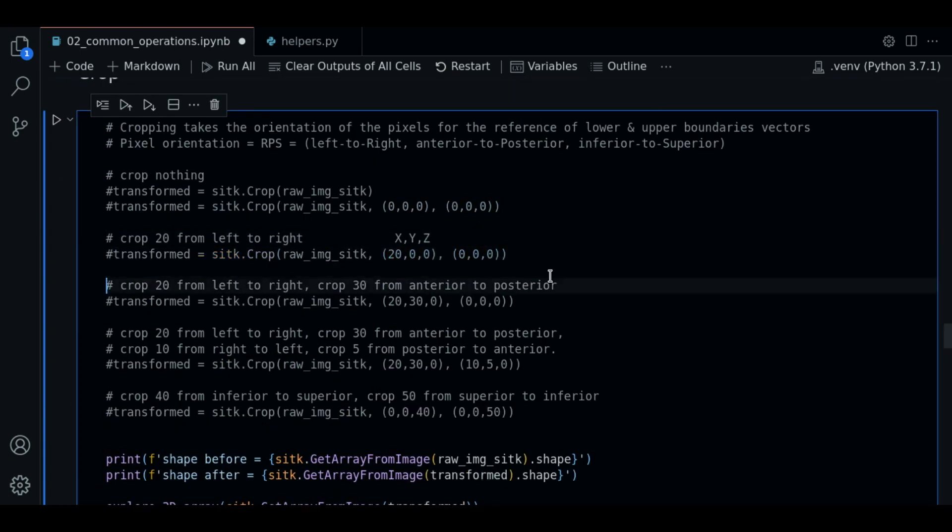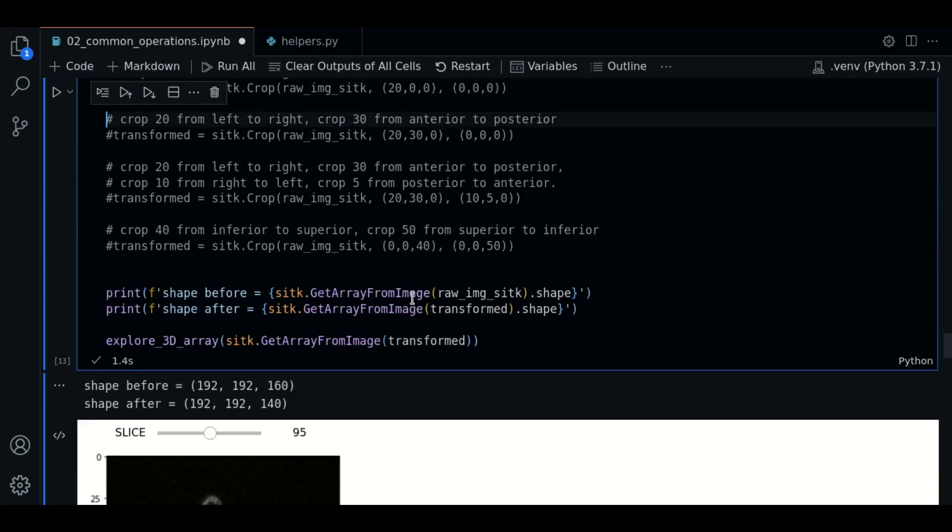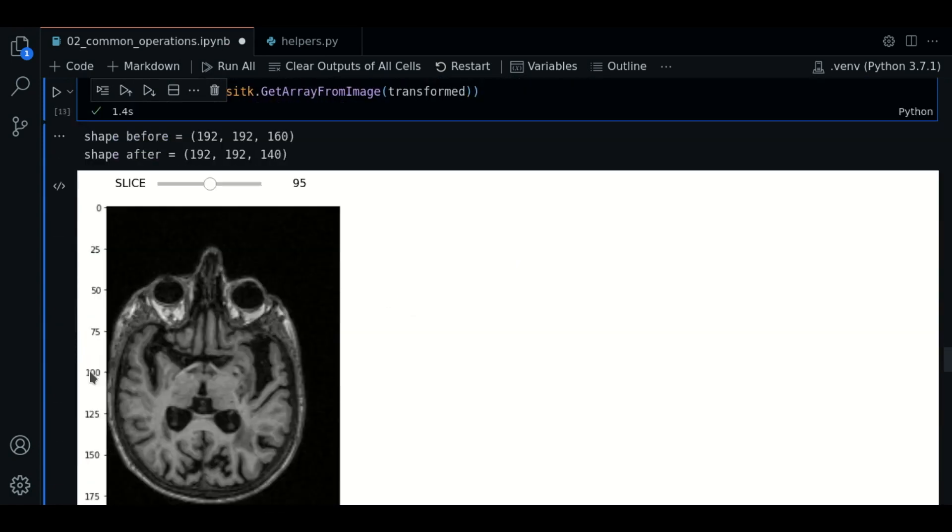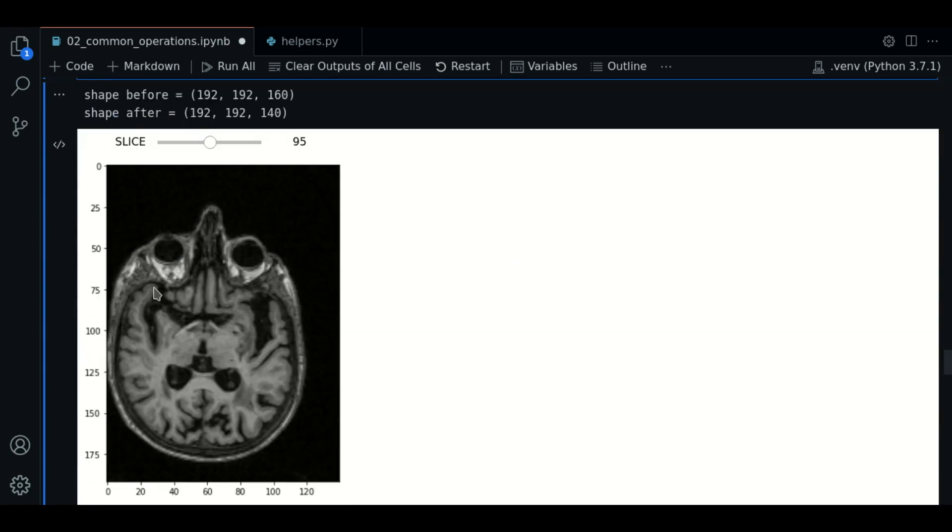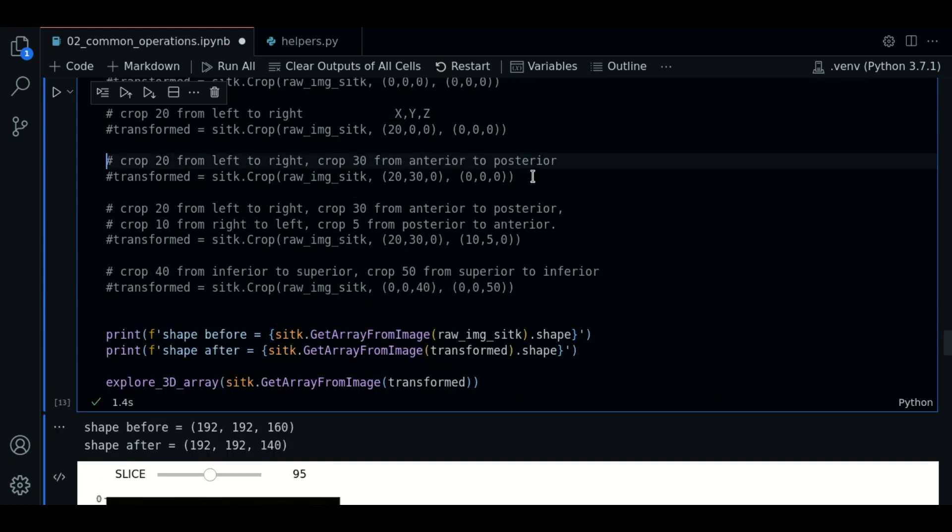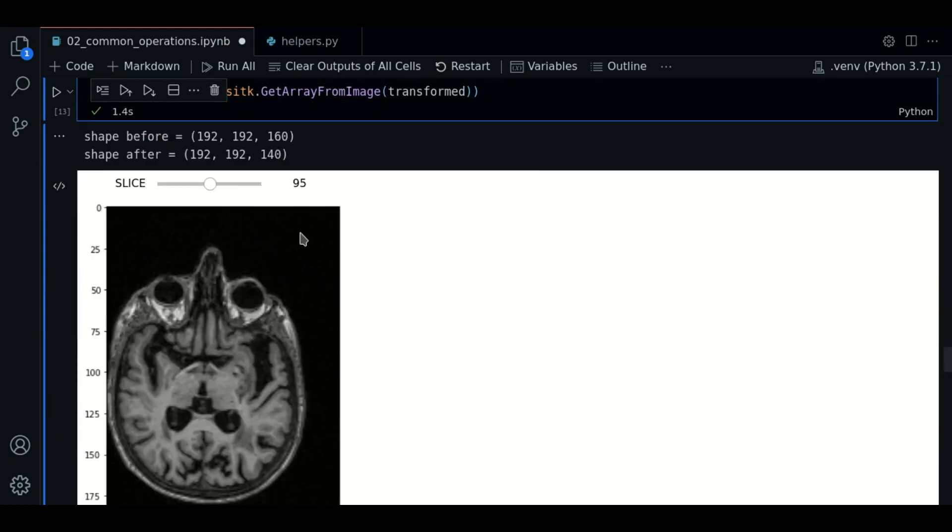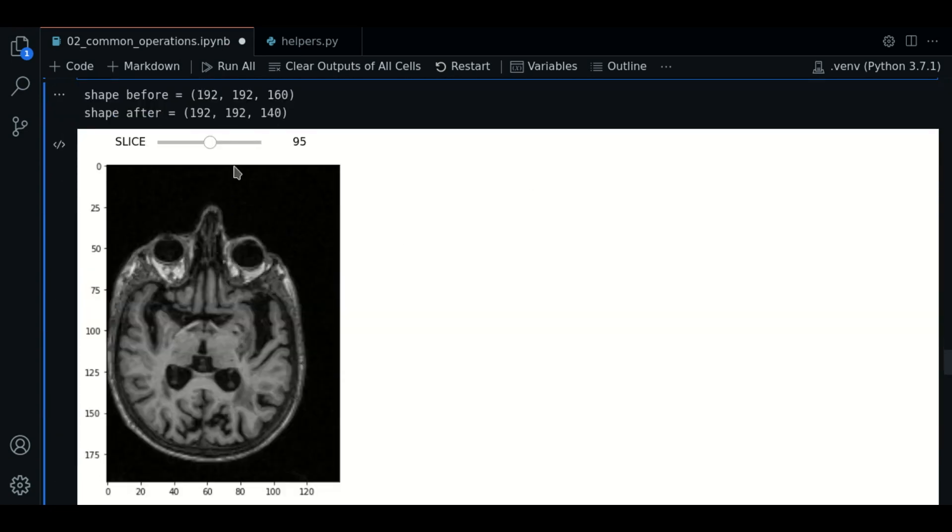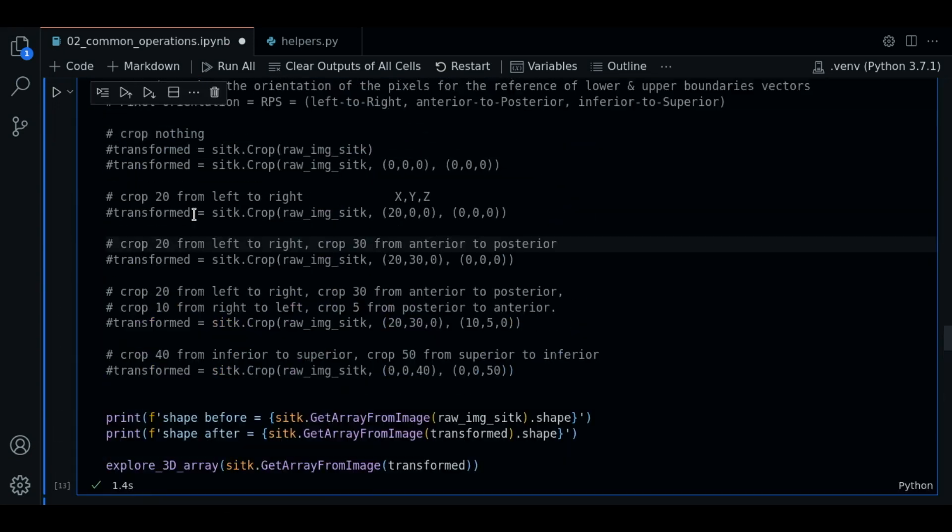We want to crop the same as before but also three units from anterior to posterior. So in this case our goal is to crop this section. And we are now going to crop this section too. So let's see.